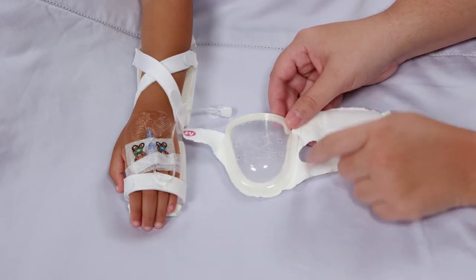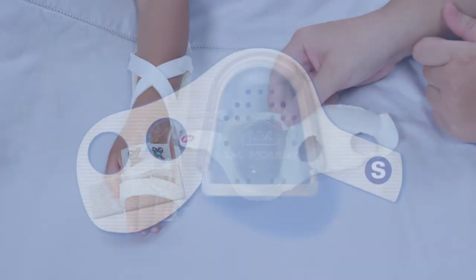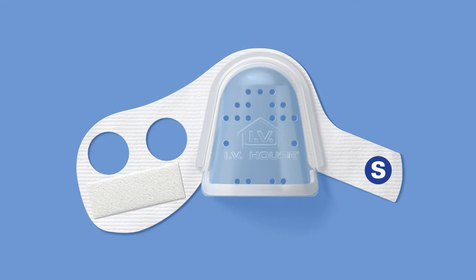After securing the IV site, tape the loop of tubing small enough to fit entirely inside the inner curve of the dome. The IV House UltraDressing works for either hand.